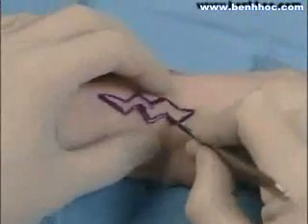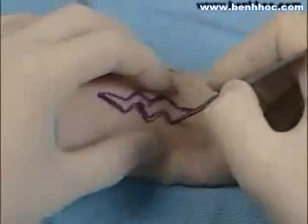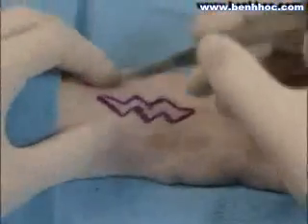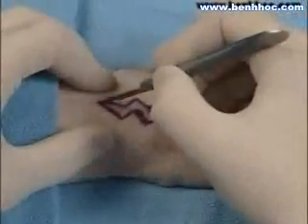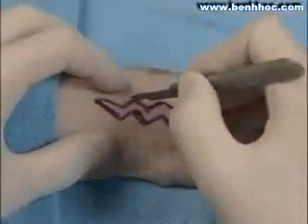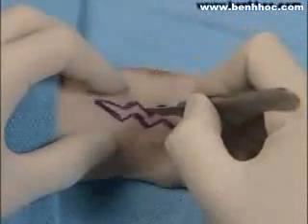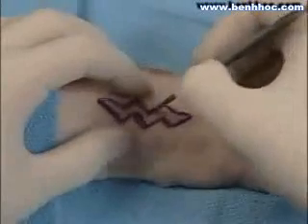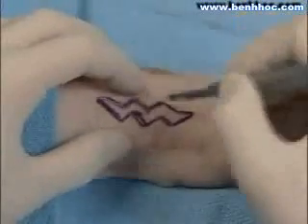So here in this example we're using a W-plasty, and again the peaks and valleys are such that the peak on one side corresponds to the valley on the opposite side. The limbs of these W-plasties should not be any greater than 5 to 7 millimeters in length. The angles you can see are not less than 90 degrees. They're broader than 90 degrees usually, or at least 90 degrees.